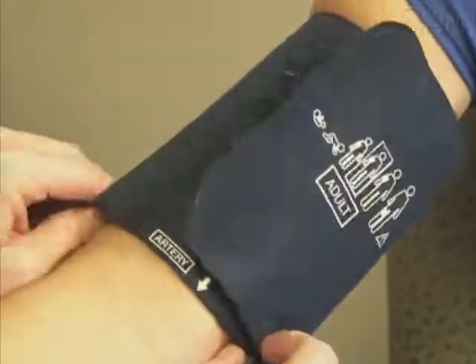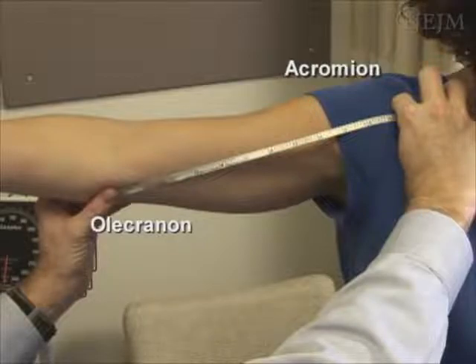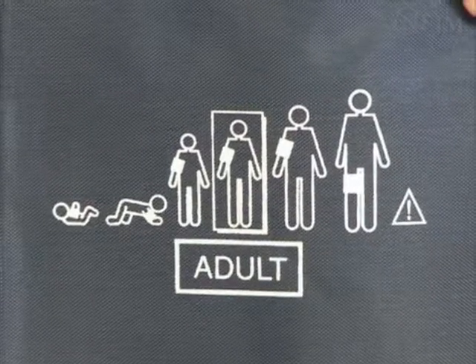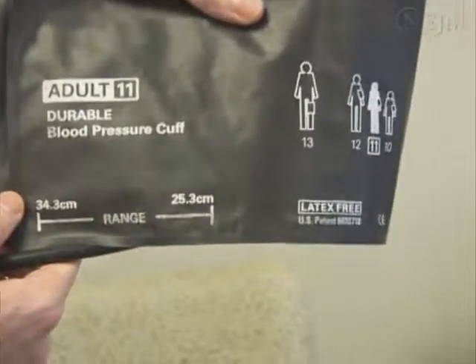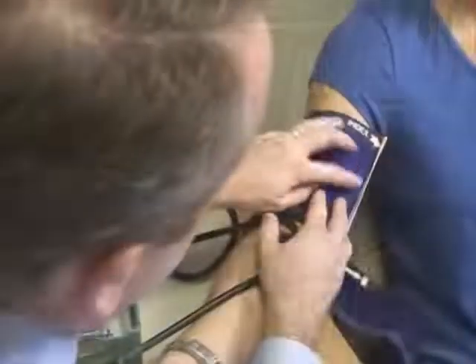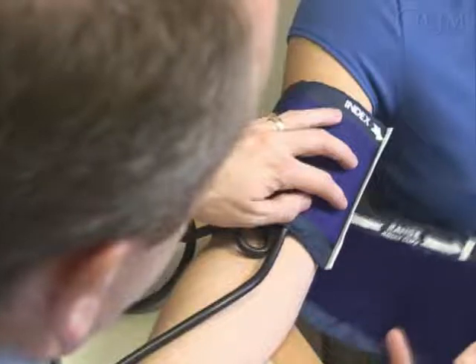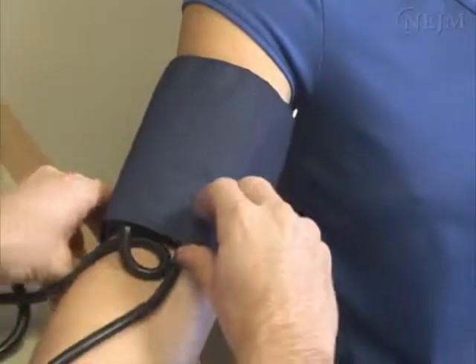A common error in taking blood pressure is the use of an improperly fitted cuff. Selection of an appropriately sized cuff requires assessment of the arm circumference. The midpoint position is determined by measuring the distance between the olecranon and acromion processes, and the arm circumference is then measured at the midpoint. Cuffs typically are marked with acceptable sizing indicators to facilitate proper fitting. However, it is more important to use a cuff that is appropriately sized for the arm. Cuffs should be marked with an index line that runs perpendicular to the length of the cuff and a range line that runs parallel to the length of the cuff. The index line should fall within the range line when the cuff is secured to the upper arm.